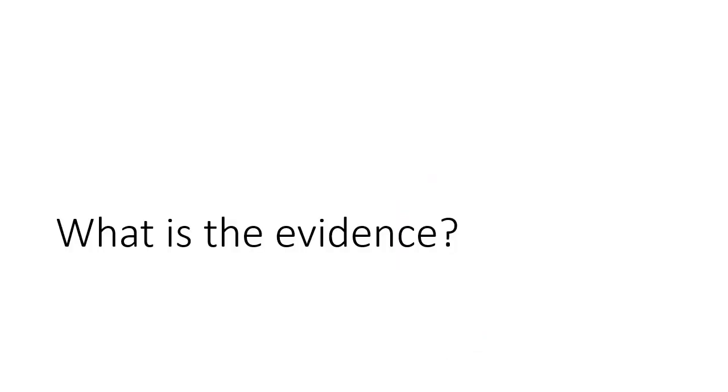So you may have heard a lot about PA catheters. Some people love them, some people hate them. So why is that? What's the evidence behind their use in critically ill patients? Back in 1970, that's when Swan-Ganz published their first paper on the use of the PA catheter in humans. It was catheterization of the heart in man. Now the title was a little bit longer, but I felt like that was the meat of the title.